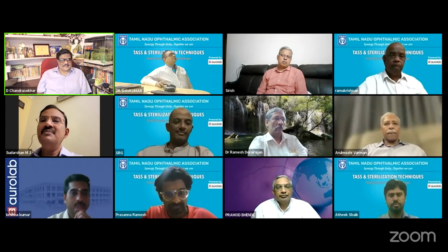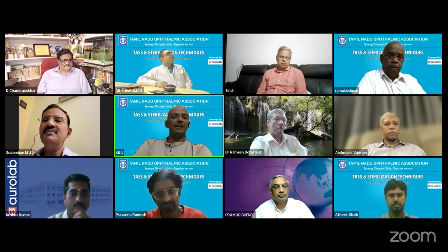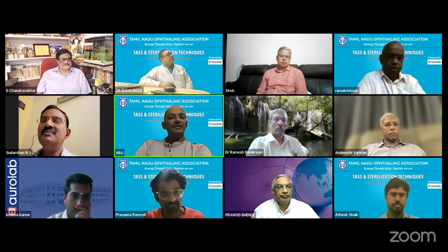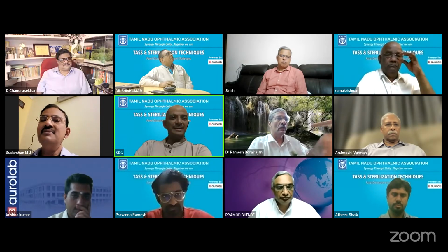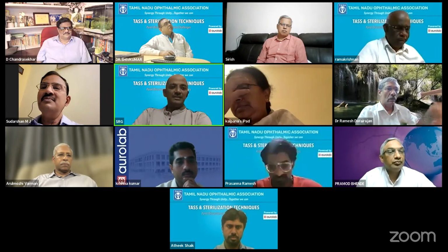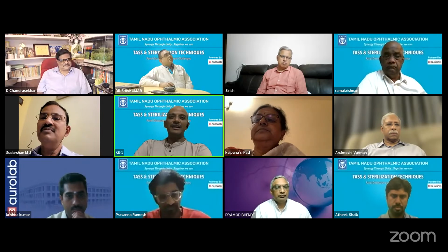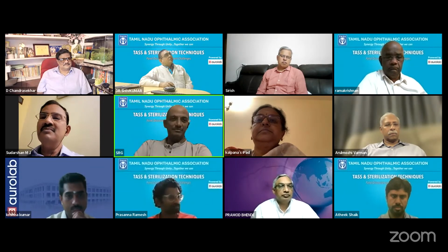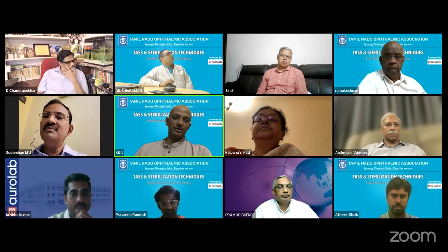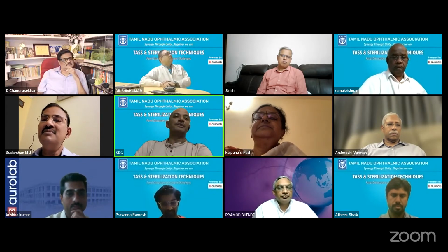So Dr. Sriram, you're thinking yes, TASS. Yeah, I just wanted to reiterate what Dr. Kalpana madam said and add a couple of points. See, the name is self-explanatory. It's a toxic reaction. And the turnaround time for anything left in the anterior chamber is hardly less than 6 hours. So let us say you operate today evening and open the eye tomorrow morning. If the eye was fine, then anything coming after that is very unlikely to be TASS, because by then whatever you left behind in the anterior chamber will go, except obviously the IOL.